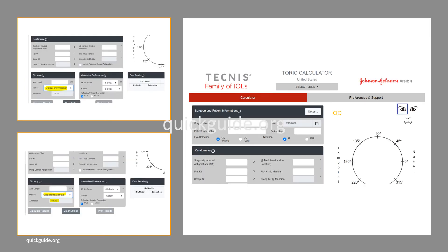This is a TORIC calculator of a major multinational company — specifically the Tecnis TORIC IOL calculator — and it recognizes this point. You can find both immersion biometry and optical biometry A constants listed in the same bracket. If you have an ultrasound A constant, that is in a separate bracket. In a separate video in the future, I may cover the topic of A constant with ultrasound biometry.